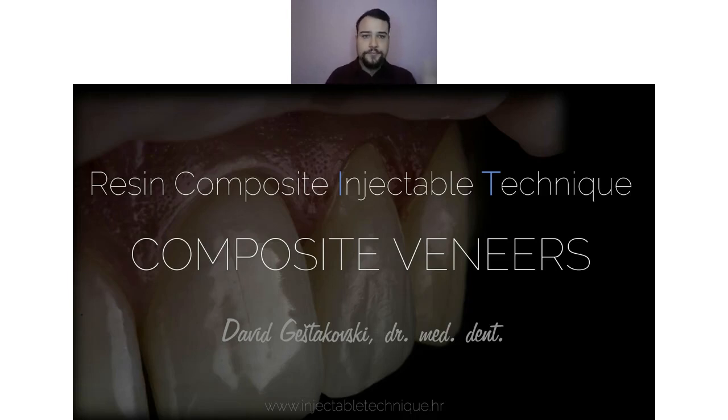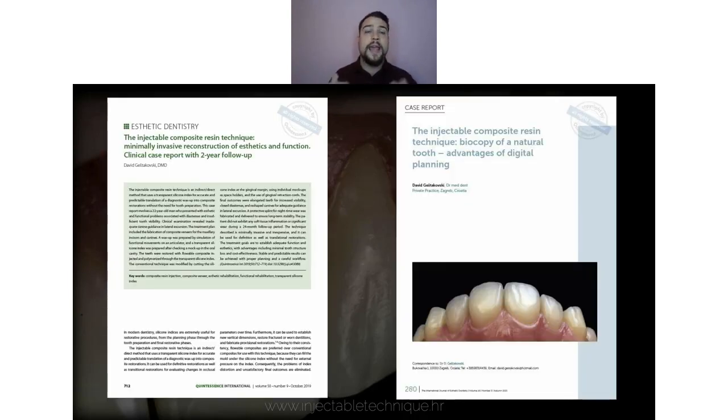Regarding this technique, I'm working with it more than 5 years so far, and I have some publication on this topic. The two of which I would point out are the one from Quintessence International from 2019 and the one from International Journal of Aesthetic Dentistry. Both of them are uploaded on my educational platform, which you can find the link in the bottom of the slide, www.injectabletechnique.hr, where you can read those articles.